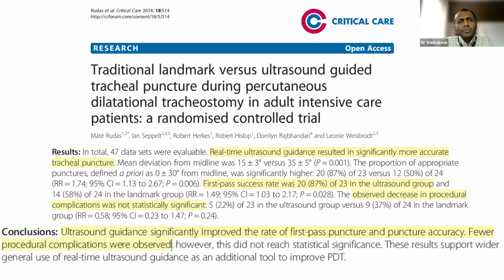So one study compared traditional landmark versus ultrasound guided tracheal puncture during percutaneous dilatational tracheostomy. It is a randomized control trial which showed that the real-time accurate tracheal puncture and the mean deviation from the midline was quite less, 15 degrees plus or minus 3 degrees, when compared to the traditional landmark method, where the deviation was quite huge statistically.